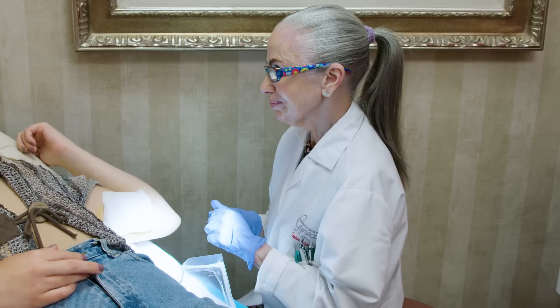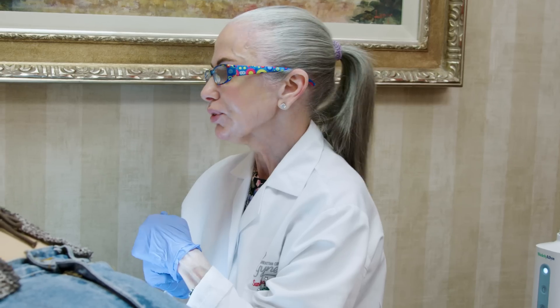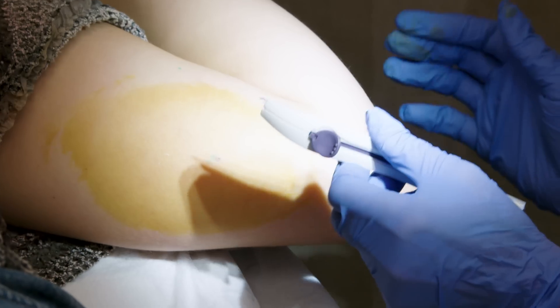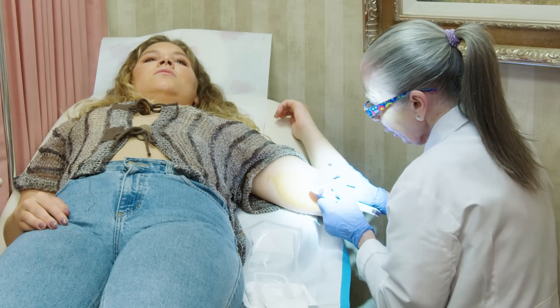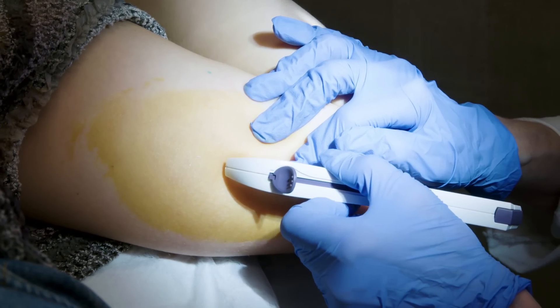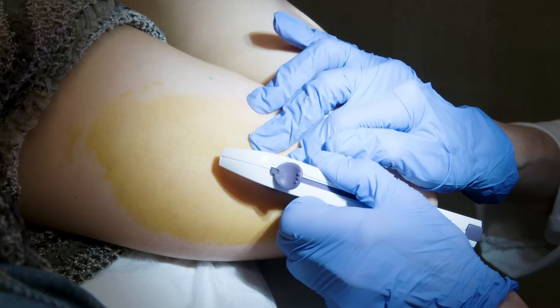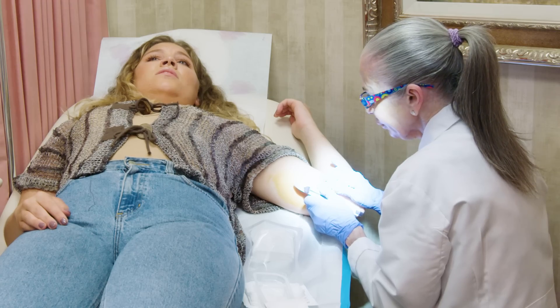You may have some unpredictable bleeding — 10% of women want their Nexplanon removed because of that. We're starting, okay? Okay, I'm okay. You okay? Yeah. Actually, you're almost done. How are you doing? Great.